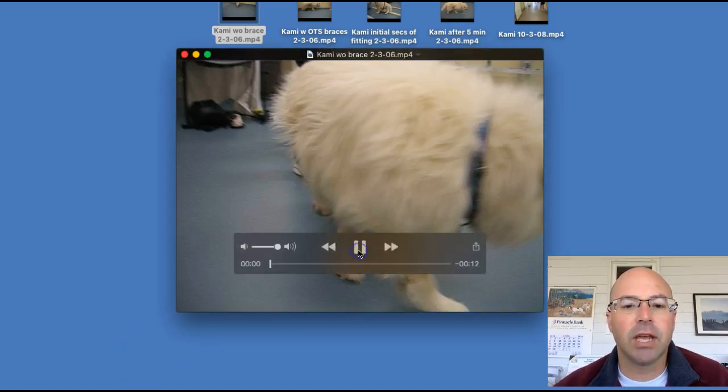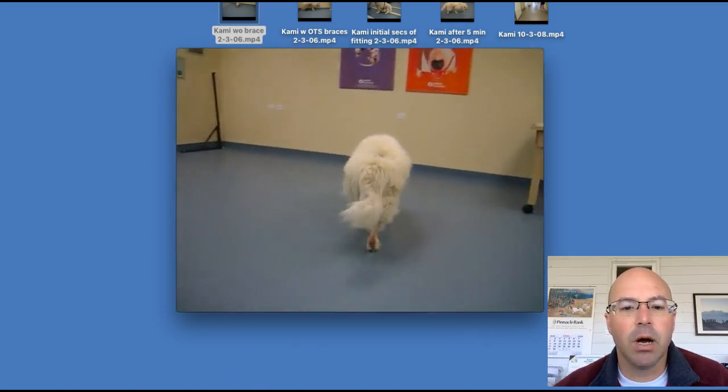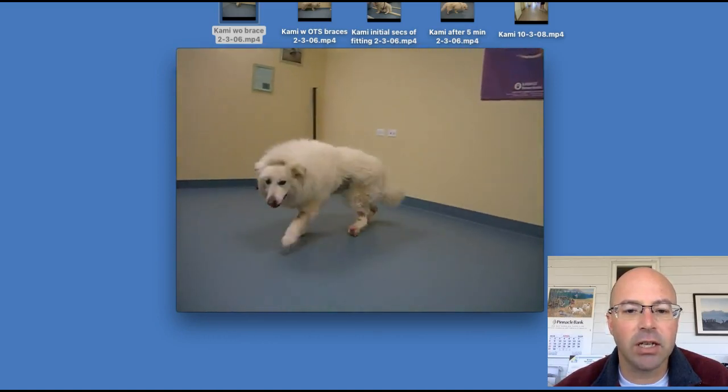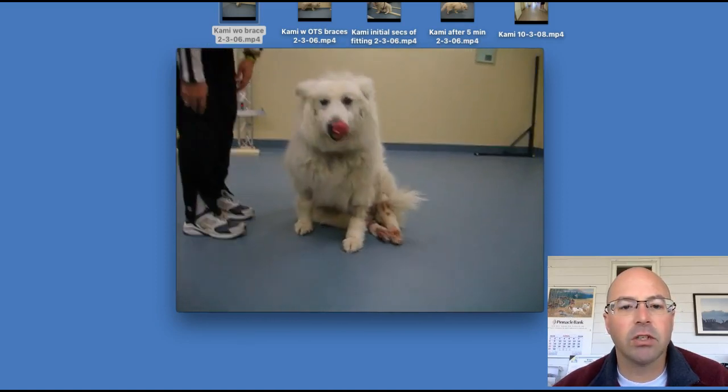Here's Kami walking here. You can see how much she's dropping. As she walks around, you can see she's catching her toes and knuckling, and all the sores that she was having. She was having a lot of trouble.